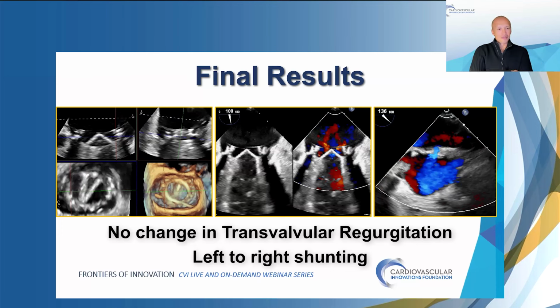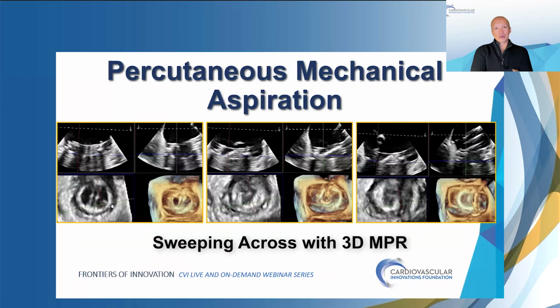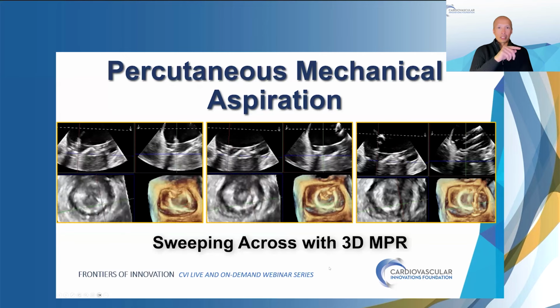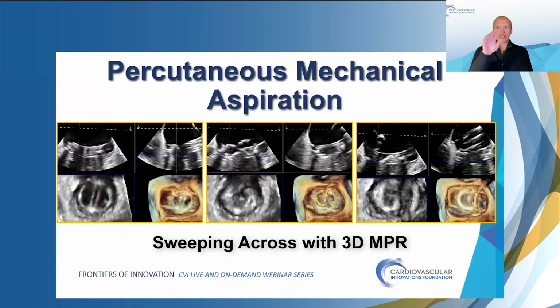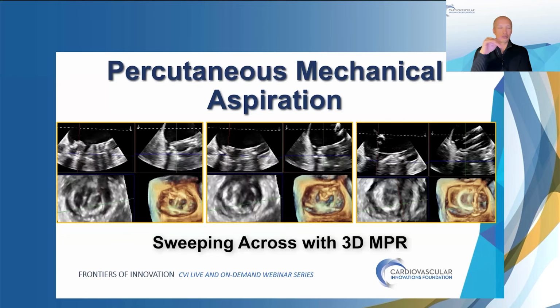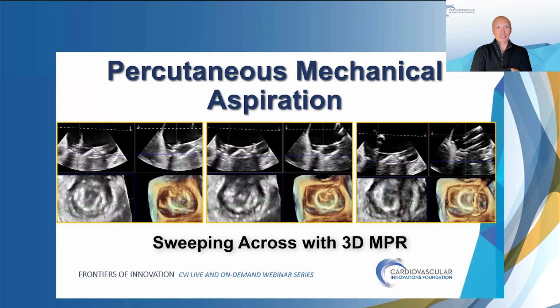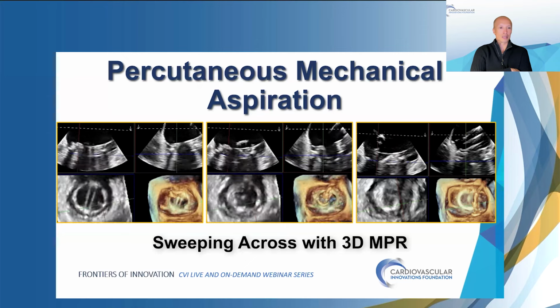One thing, did you get any hypotension, Paul, when you started? The patient tolerated it pretty well. And then the other thing is, if you're looking at the MPR images, so what Nadira showed earlier, we talked about how, reaching across, you have a single curve, and I had a little bit of an aorta hugger, but it was still able to reach. And I think to your point about having the sheath, the transeptal a little bit lower, helps with that. Because if you have too much height, it can go against you.